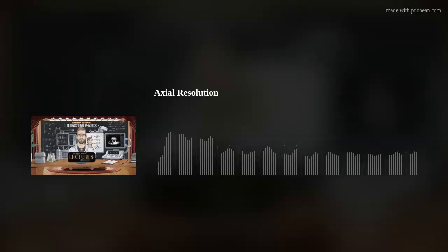Right, and this is where damping comes in. You know how when you hit a cymbal, it rings for a while? Yeah. Well, if you put your hand on it, it stops ringing faster. Damping does the same thing to the crystal in the ultrasound probe. Wait, so they're literally stopping the crystal from ringing too long? Exactly. More damping means fewer cycles, which means shorter pulses, which means better resolution. It's like you're controlling how long the crystal vibrates.